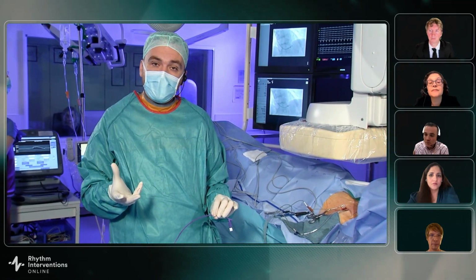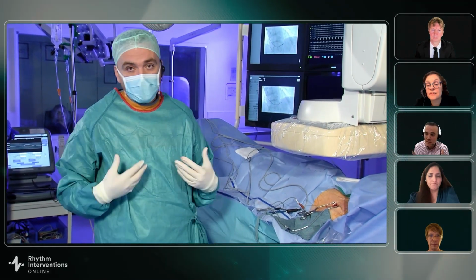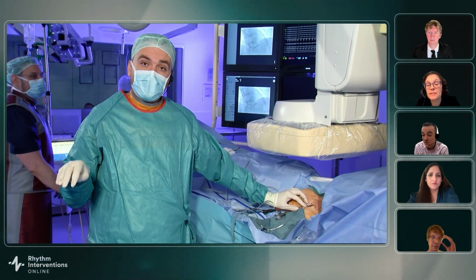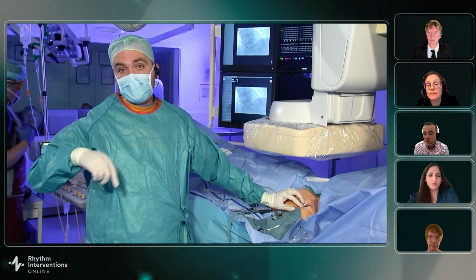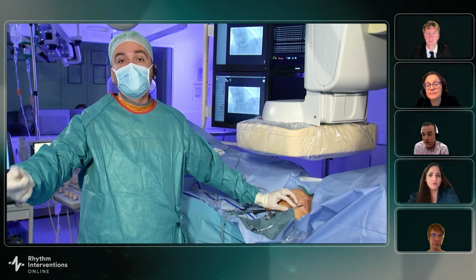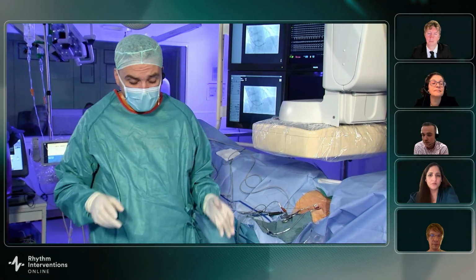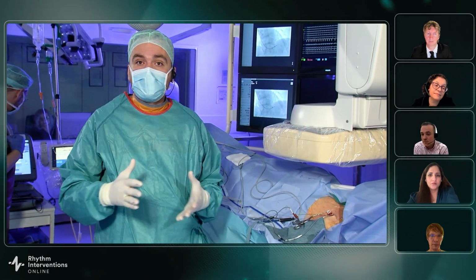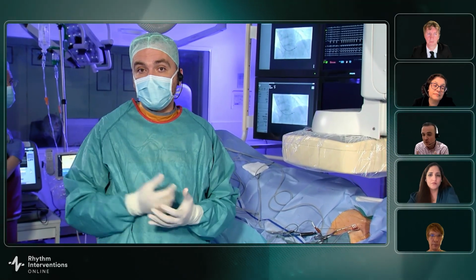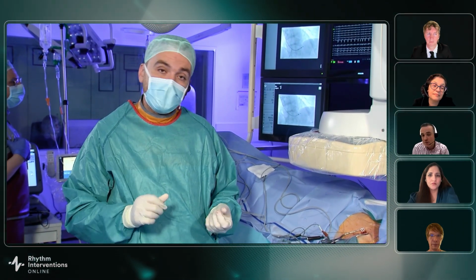Talking about all the documents, the most specific sign is the transition. If we have a transition from non-selective to selective, or non-selective LV septal pacing, it's 100% specific to say I have a successful LBB pacing case. Of course, we can look only at the R-wave peak time in V6, which is also around 90% specific. Also the difference between V6 and V1. So there are many other parameters, but the most specific parameter is the transition.